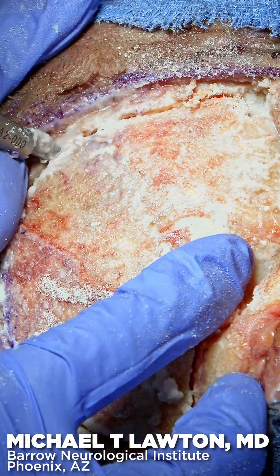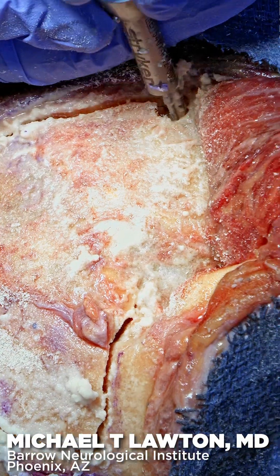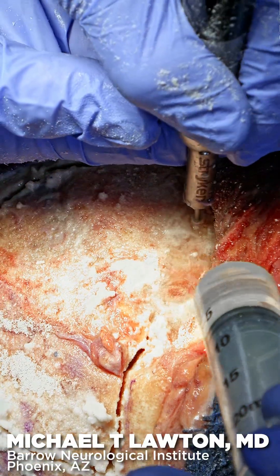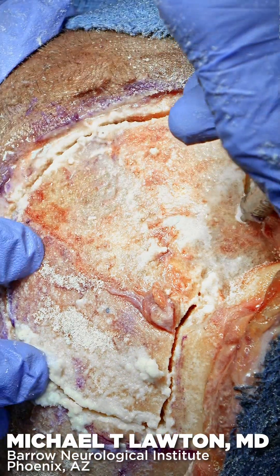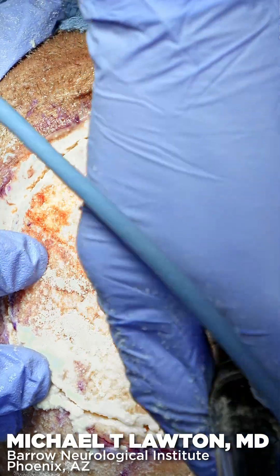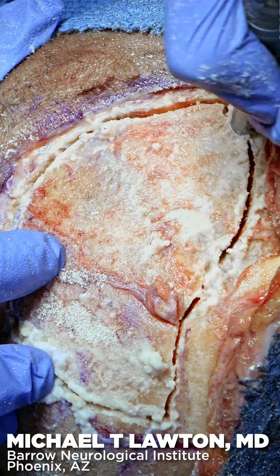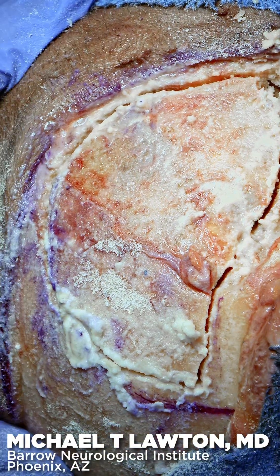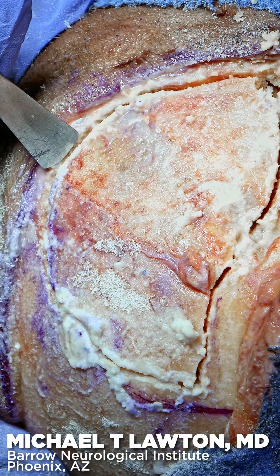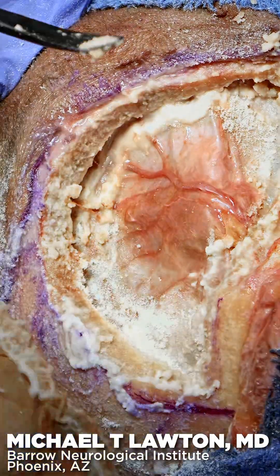Then we'll come back around this circle here. Now I'll go along the temporal side. And there I'm feeling the pterion on the other side. So now this flap is based on this pterion piece, and we can just elevate and snap what remains here. There it goes — there's your flap.